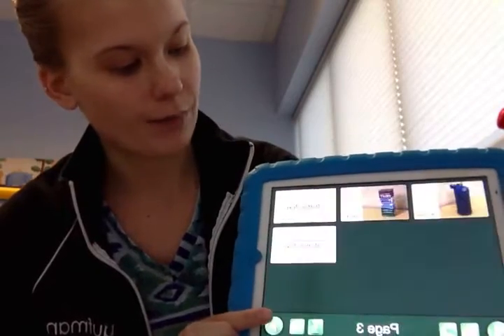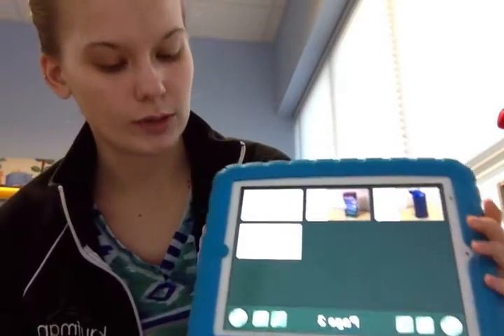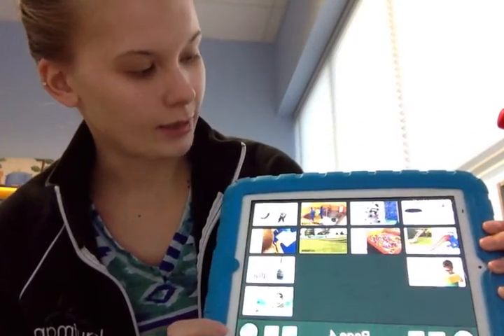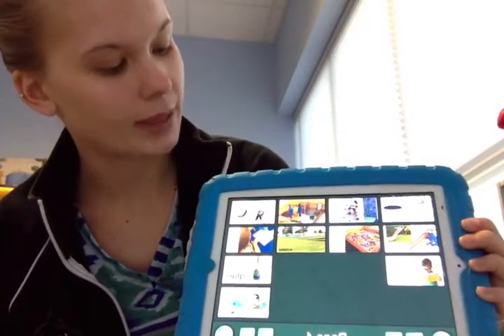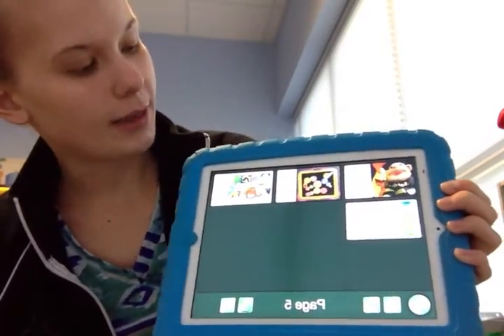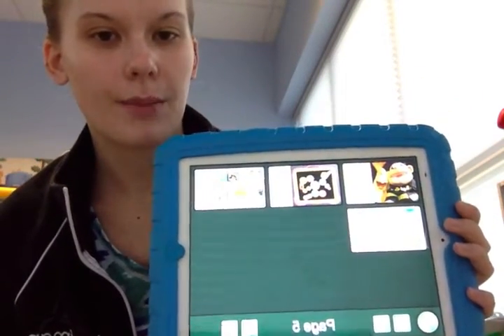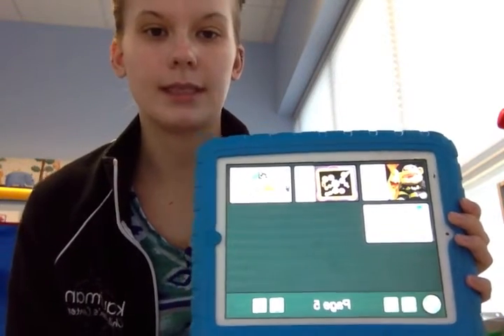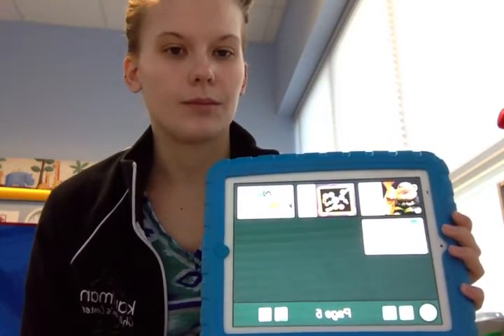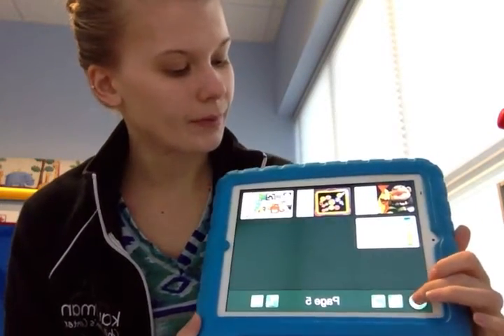Once they are able to move on and select them independently, we'll also show them different pages, for instance, this child has water and juice, and another page they also have activities of jump and climb and the ball pit, and then there's also certain toys that he really likes at the table, which are puppets and bubbles. So we'll show those to him as we see that he has preferences for them, and then also guide his hand towards selecting the picture.